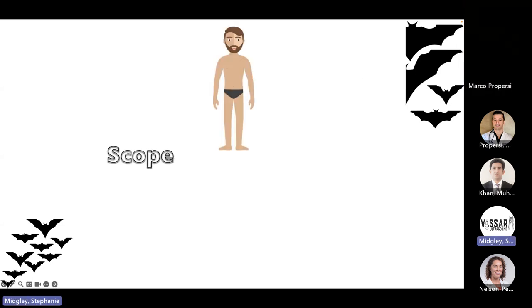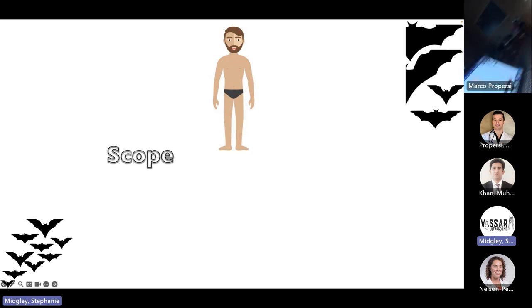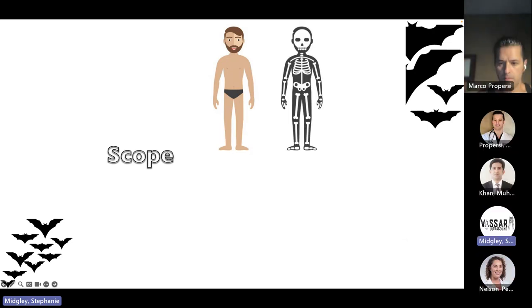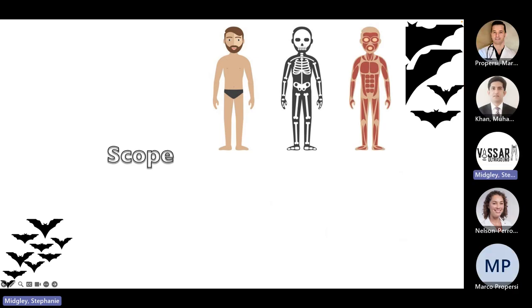There we go. For the scope of ultrasound, for those folks who are not familiar with it, it is ginormous. We can do everything from skin and eyeballs to bones for fractures, joints, arthrocentesis, hematoma blocks, for musculoskeletal, for tendinopathies, for tendinitis. You can do it for tenosynovitis. You can do it for muscle tears. You can do it again for eyeballs, nerve blocks, for pain control.